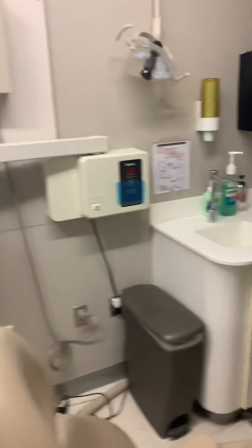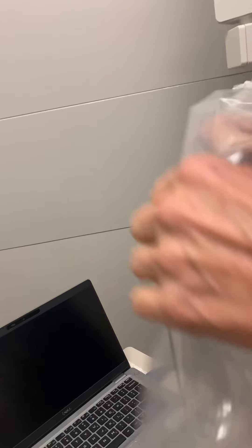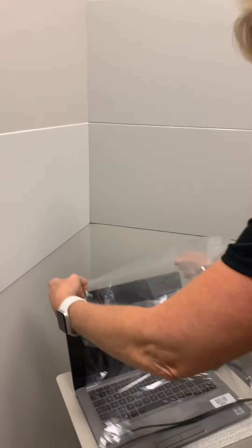Next up is going to be our cover for our laptop. The cover has a little kind of sleeve on it that goes over the back of the computer — you can see where her hand is there. That's going to go over the back of the screen, and the other part covers our keys.